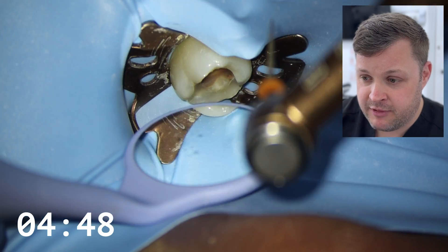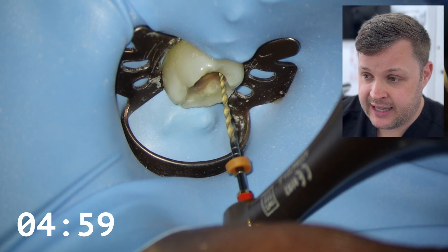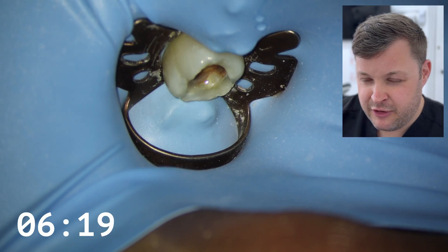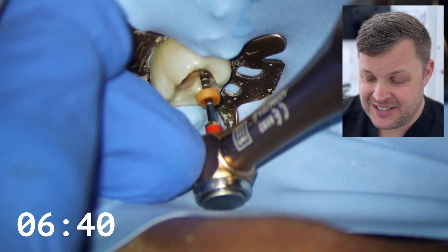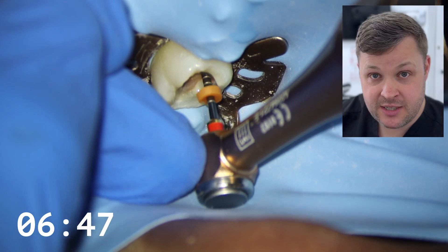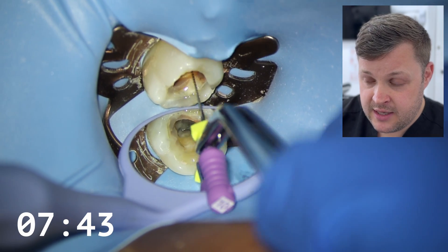We're now going to pass with our master apical file. Listen — we're four minutes in and we're already on our final shaping file. This is how quick this method is. The same technique applies: very very gently letting the file drag itself down the canal, lots and lots of irrigant. If you're getting any resistance at all, push out irrigants and possibly recapitulate. As we get down to the zero reading on the automatic apex locator, I've set it for the file to start slowing down, and when it reaches zero it reverses out. The ML is done — seven minutes in.